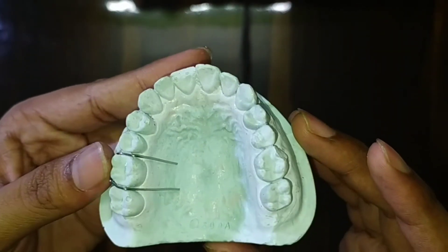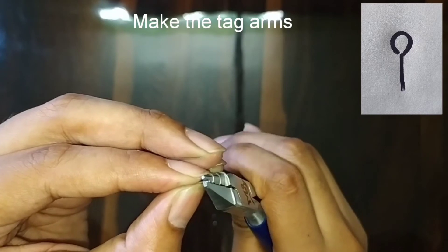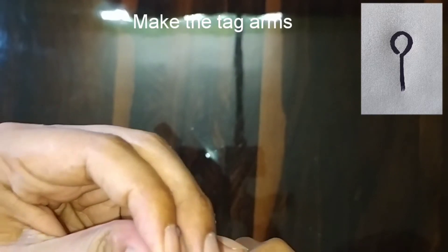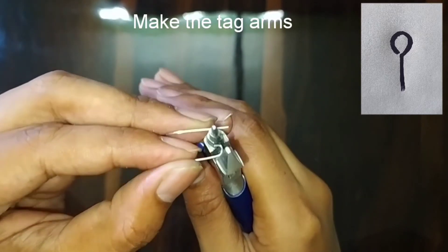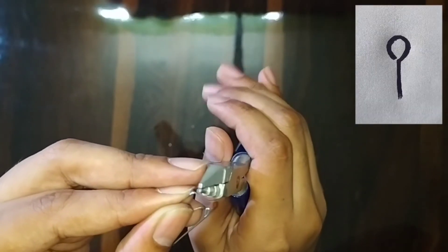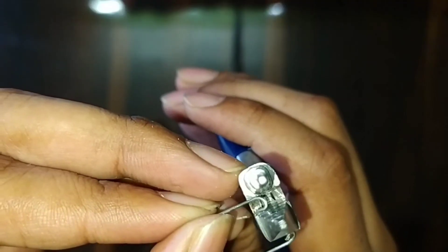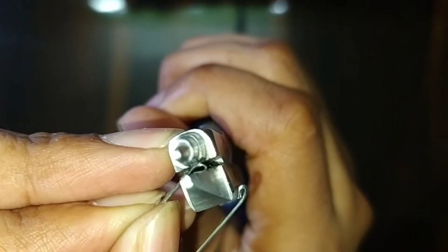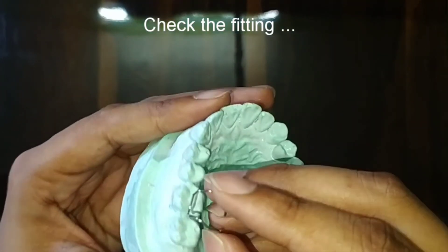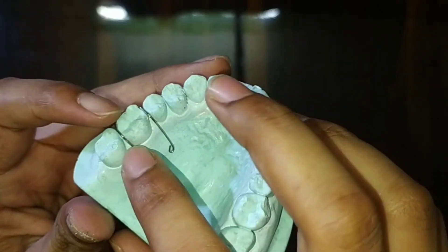We can see that the clasp is almost adapted to the cast. After this, we will make the tag arms — just give a curvature to the wire, a half circle, and then compress the wire. It will form a small tag. Do similarly on the other side too. The Adams clasp is almost ready — check the fitting on the cast and adjust it a little bit.